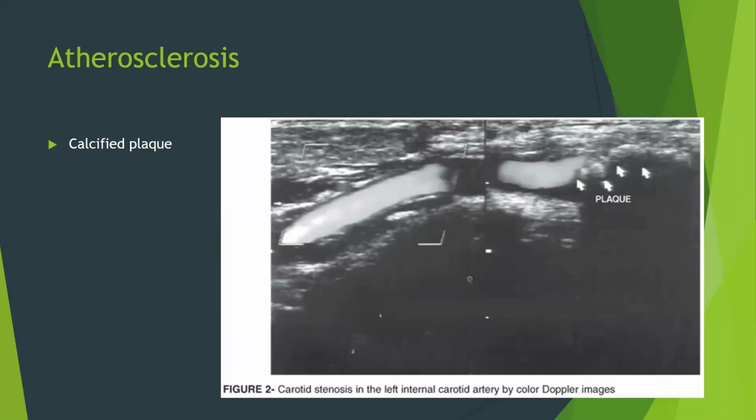Another reason why waveform analysis can be huge with carotid ultrasound is let's put a Doppler distal to that plaque and see what it looks like. Is it a good upstroke? What does our window look like? So these are important factors when we're looking at plaque like this that we may not necessarily be able to grade because we can't get a velocity at that point.